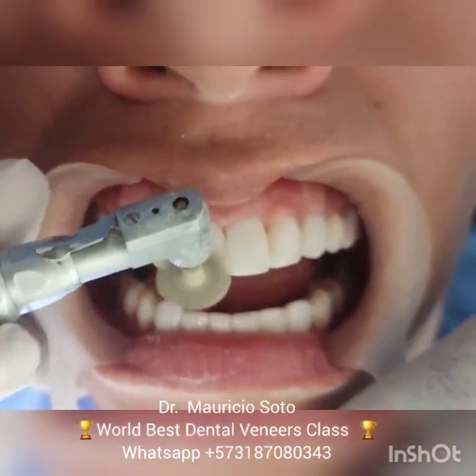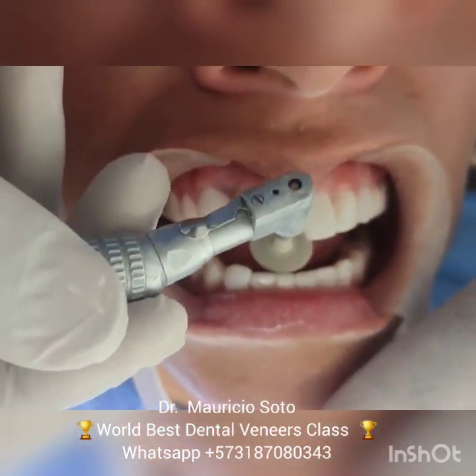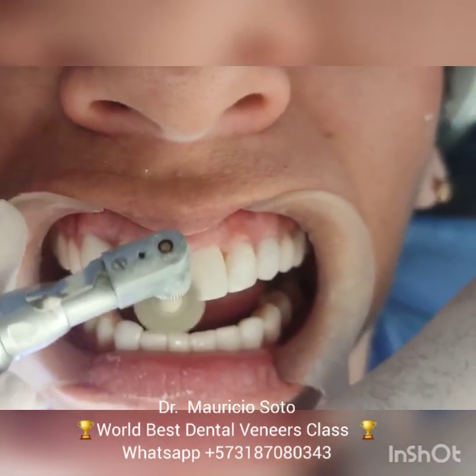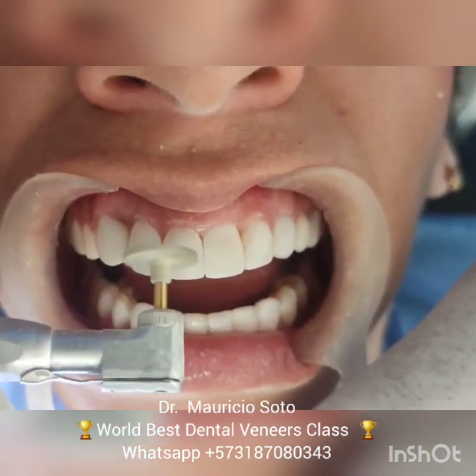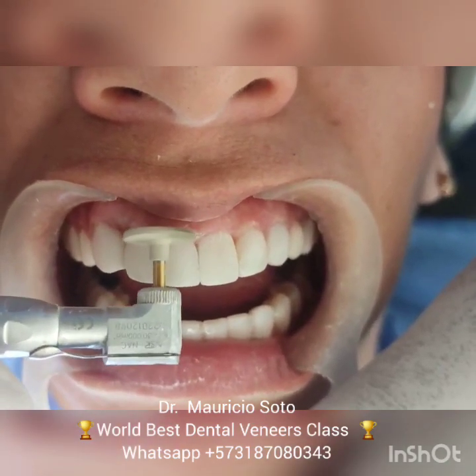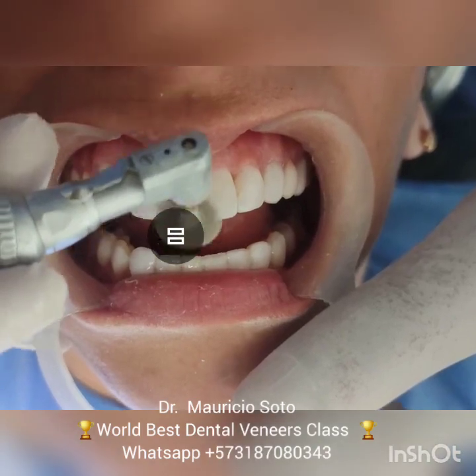The next step is polishing to obtain shine. I recommend the F-Diacom system to obtain a natural shine on the teeth and a natural-looking veneer. Take your time with this — remember, more time means more shine.